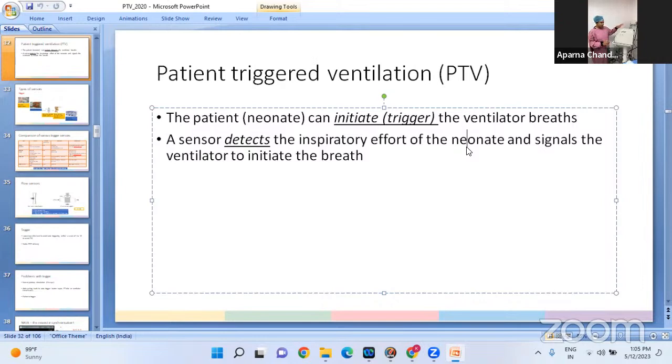So the blended mixed gas, air and oxygen mix, which is compressed and pressurized, now flows at a constant flow rate to the inspiratory tubing. The inspiratory tubing leads to the heater humidifier apparatus, and from here through the green tubing, it comes back to the patient interface. You have the flow sensor and the pressure transducer connected here.